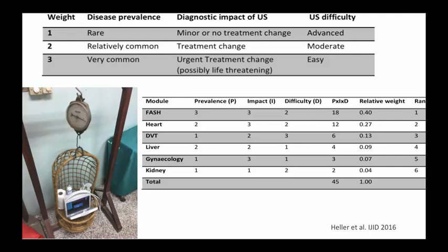And then the third consideration when you look at which ultrasound techniques to teach is the difficulty. Of course, if it is easy to teach something, you'll do it more easily. If it needs advanced skills and months-long trainings, then probably it is not very suitable for point of care ultrasound. If you take all these factors into consideration, you can weight your ultrasound modules. Obviously you don't need a scale to weight your ultrasound machine, but you can see this weighting here.